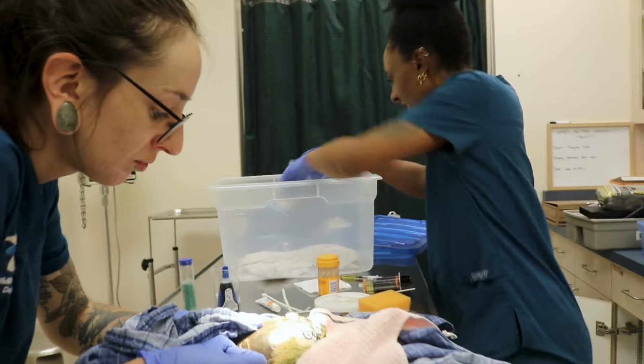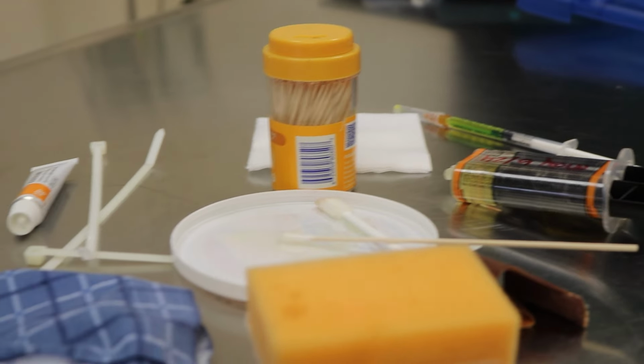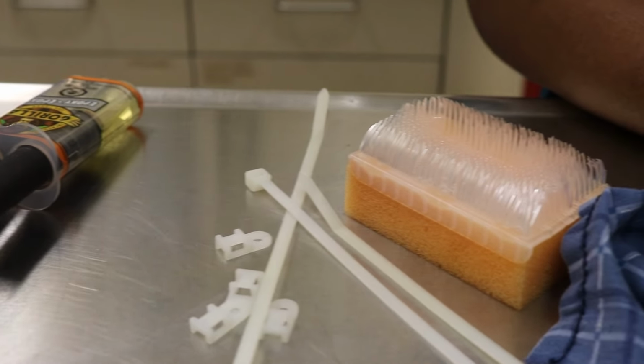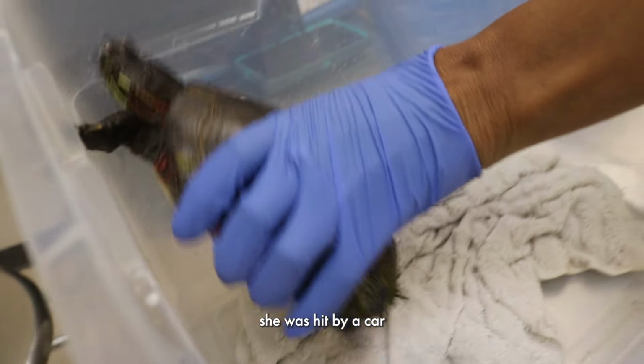Wildlife veterinarian Dr. Mickey Sneed and registered veterinary technician Victoria are preparing to stabilize a fracture in this painted turtle shell. And yes, those are zip ties. So this painted turtle came in because unfortunately she was hit by a car.